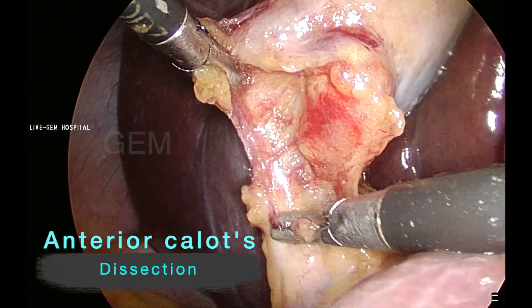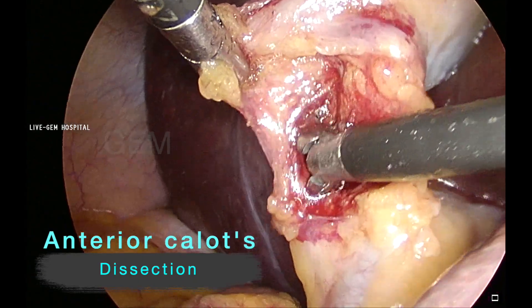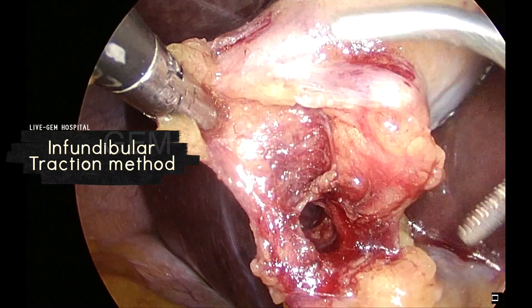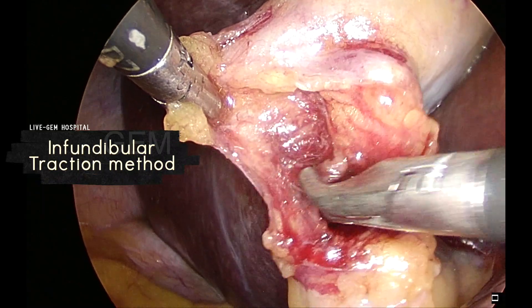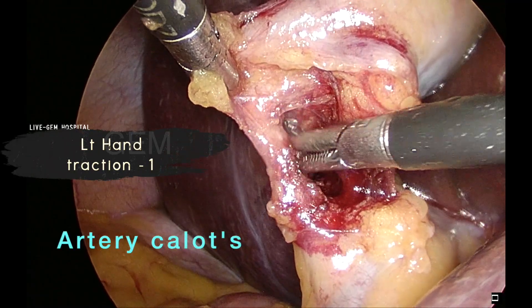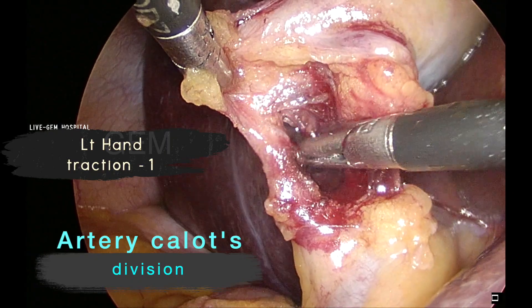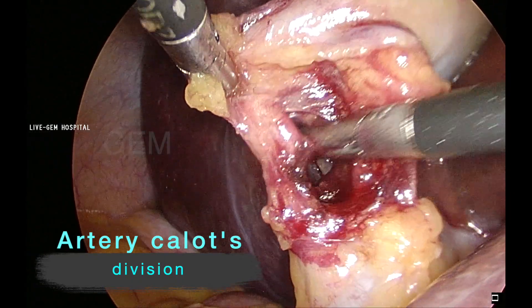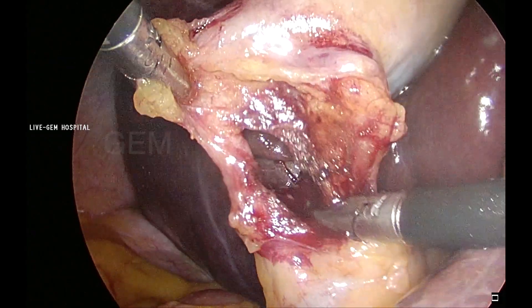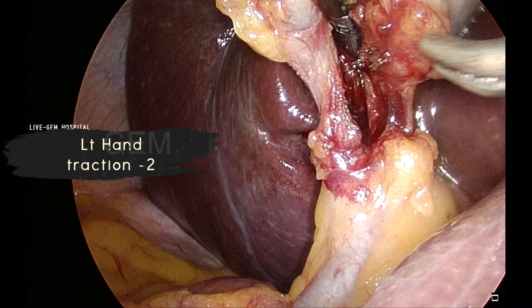Again I am holding the infundibulum and retracting it laterally, dissecting the anterior Calot's. The space between the artery and duct is dissected — and these are the arteries of Calot's, small small branches. Now you can concentrate on my left hand — how it is moving for further dissection. During this time I have a very good exposure by retracting the infundibulum like this, and now I am dissecting the artery.